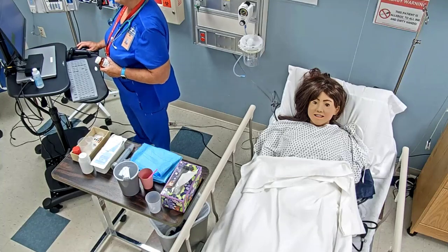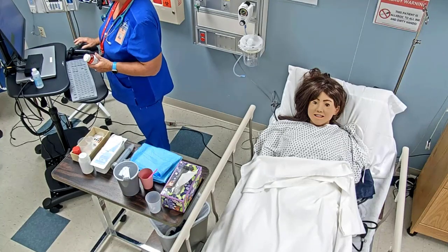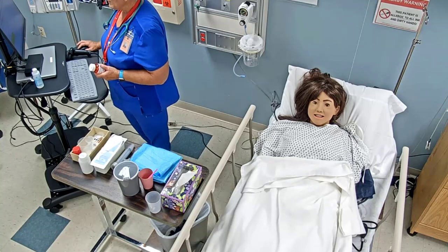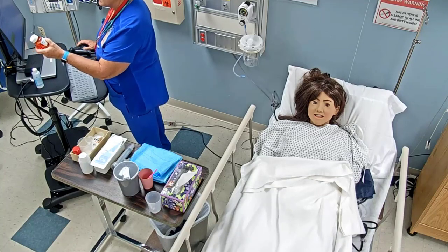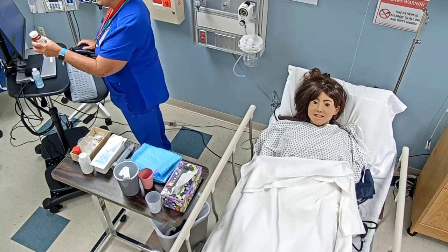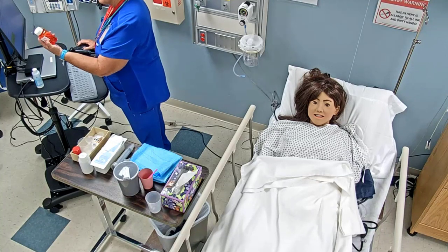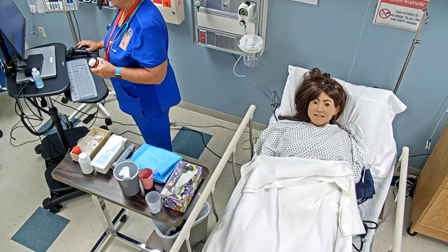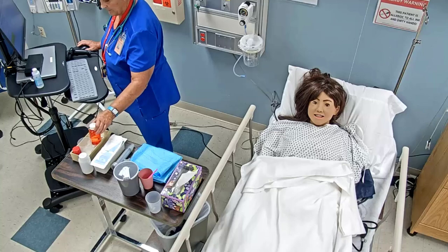I have Anna Taylor, date of birth 4/24/1991, no known drug allergies. I have Pepcid 20 milligrams oral suspension daily per peg tube at 9 o'clock. And so in my hand, I have Pepcid. It's 20 milligrams per 15 mils. Expiration 1/1/2030, and so it's intact, and since I'm giving 20 milligrams and this says per 15 mils, I'll be giving 15 mils. And that's my 9 o'clock dose, so that's my second check with that.